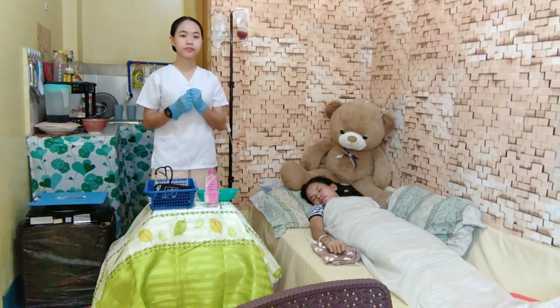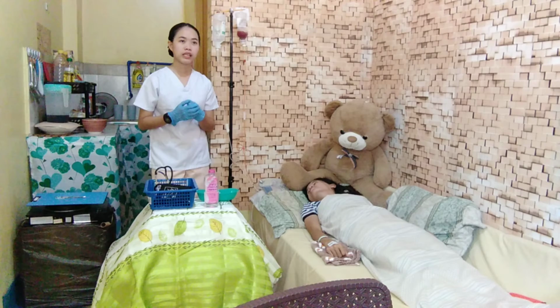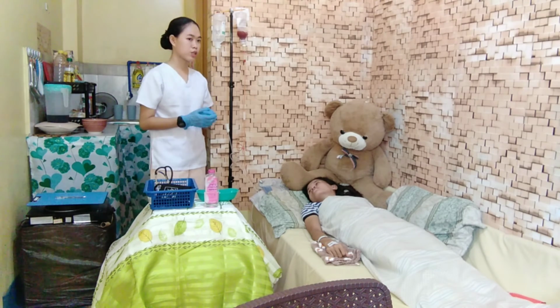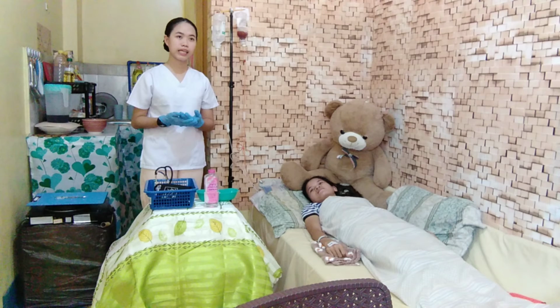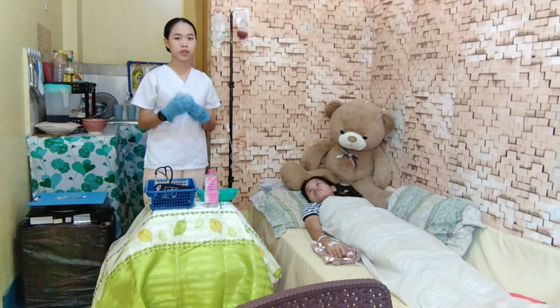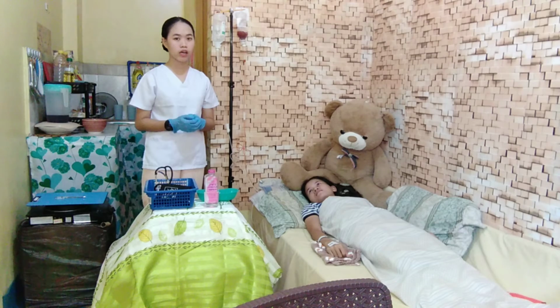And then after that, we will monitor the vital signs every 5 minutes for the first 15 minutes and every hour thereafter.